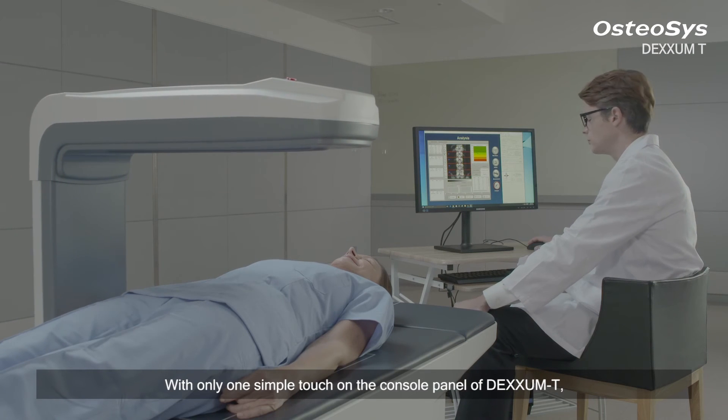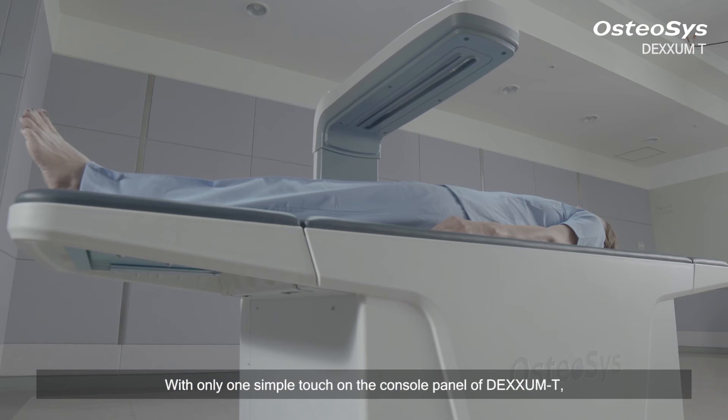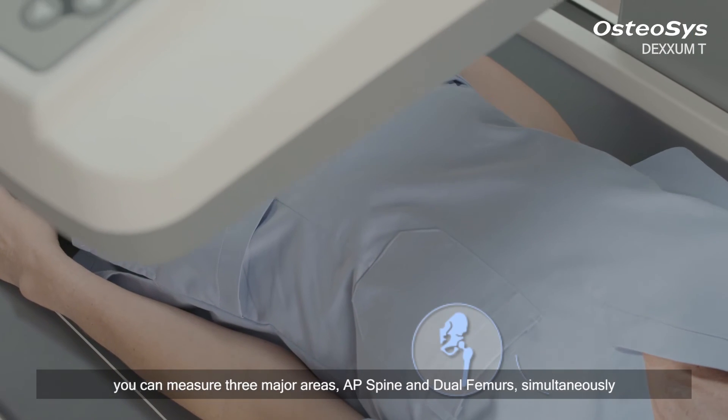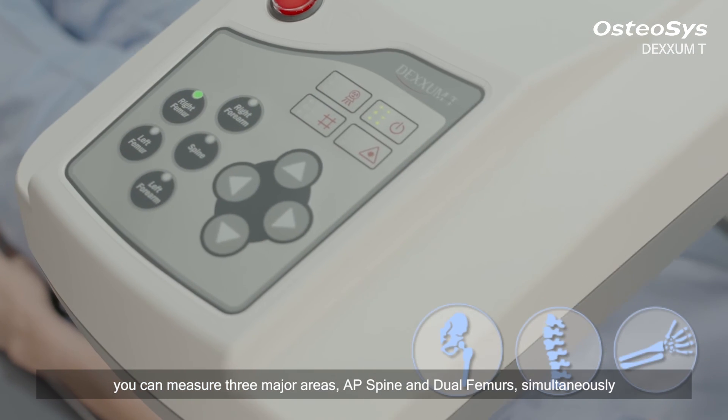With only one simple touch on the console panel of DEXXUM-T, you can measure three major areas — AP spine and dual femurs — simultaneously.